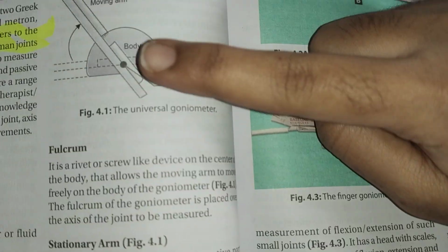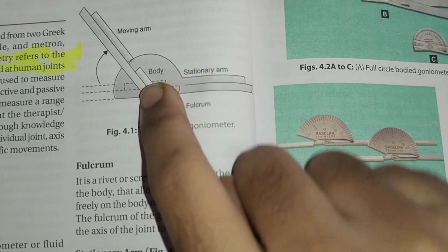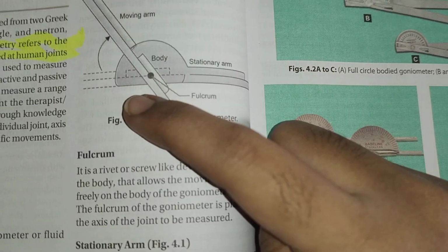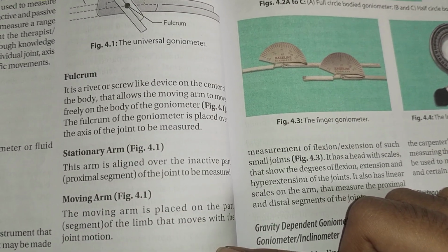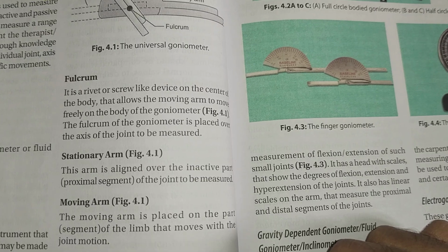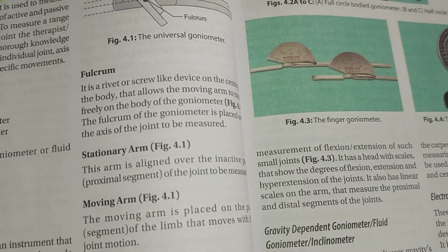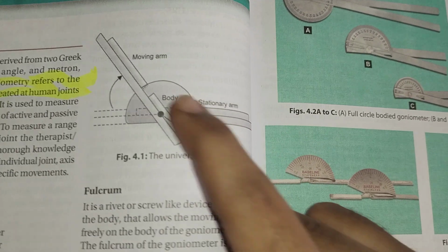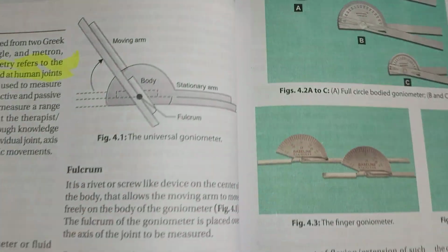The fulcrum of the goniometer is placed over the axis of the joint to be measured. This fulcrum is placed on the joint axis of the joint to be measured. And the next one, stationary arm. This arm is aligned over the inactive part of the joint to be measured. Stationary arm means the arm that stays stable. So this is the stable arm, and then this is the moving arm.